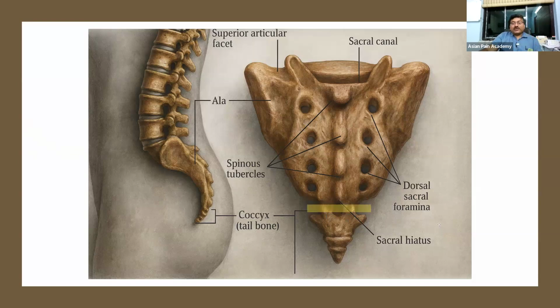When we are putting the probe in this manner, the undulation or bony margin that we will see will look like this. On one side, it will be like this. So it will be one cornu, then after the cornu, there will be a flat area, and then again the cornu.